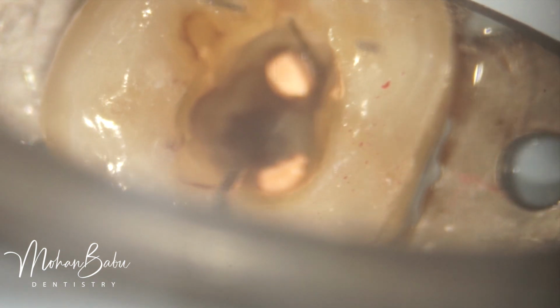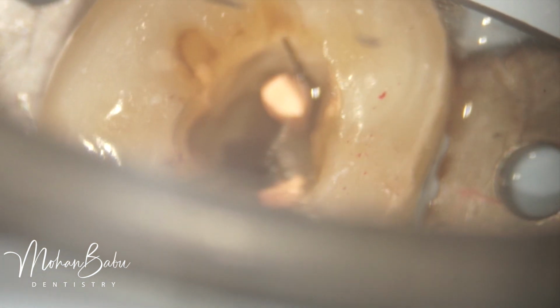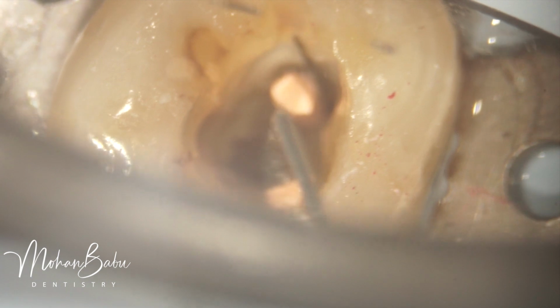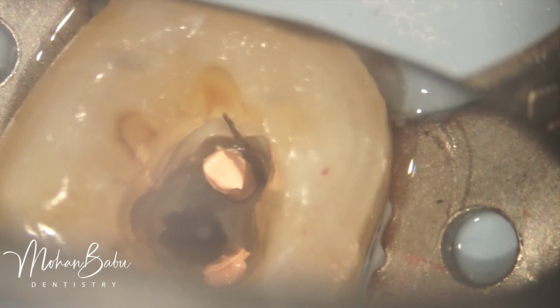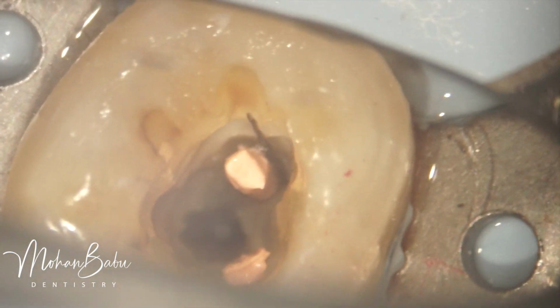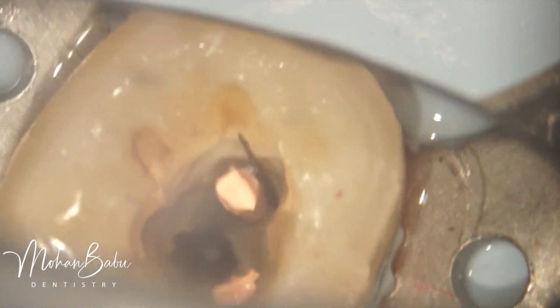Now you can see clearly once the fluids are removed. Before doing that, I had kept some GP inside the distal and the Mesio-Buccal canal, so that if the file came out, it would not go into another canal. Now we are checking the radiograph to confirm that the fractured file segment has totally come out of the canal and no part is remaining.